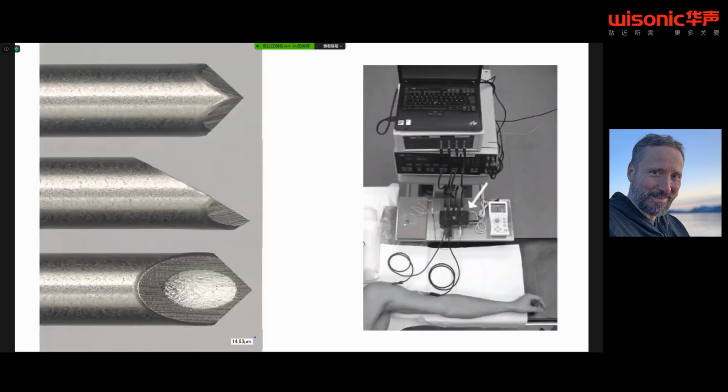We are very motivated to develop this method further so that it can be used in a not too far future in our clinical practice. There are a lot of challenges. We try to design an optimal needle for impedance measurements during regional anesthesia procedures, and we also try to develop a suitable device that can be easily used in our clinical practice.